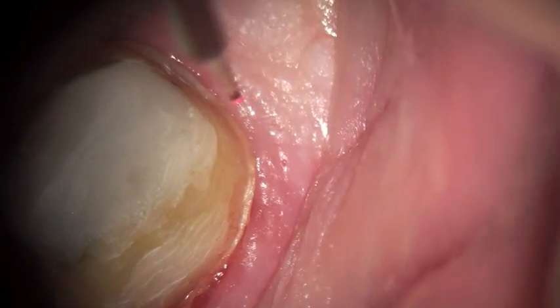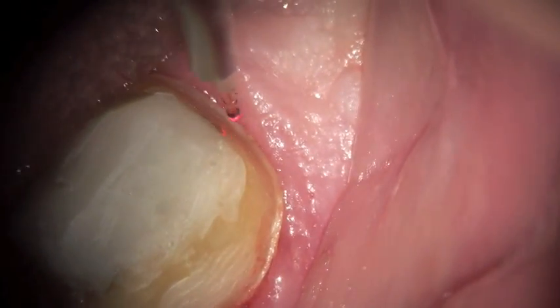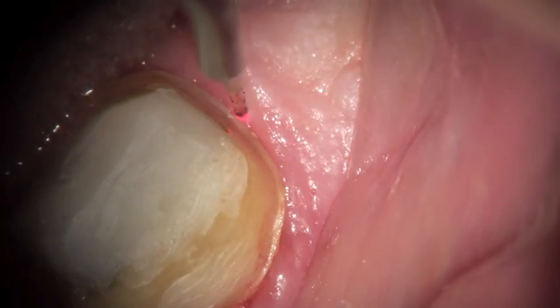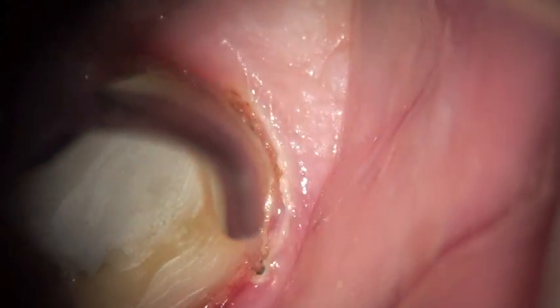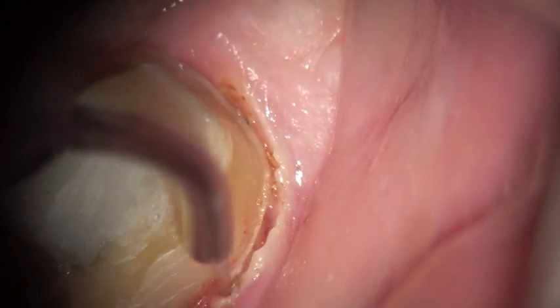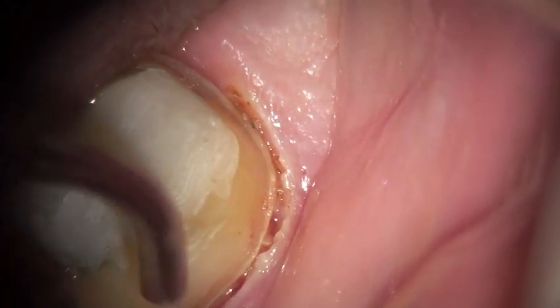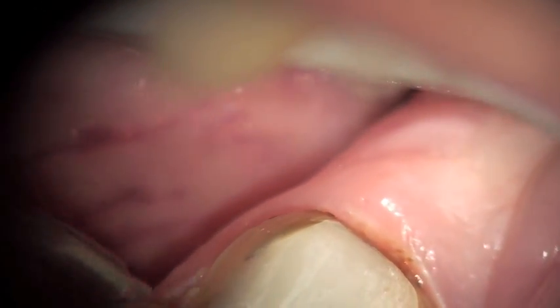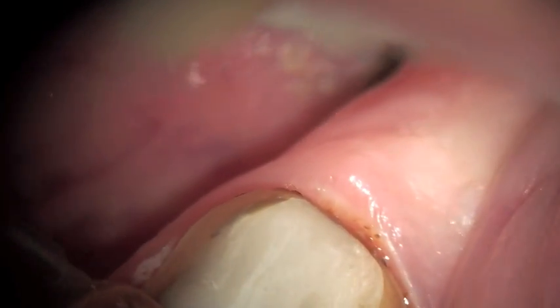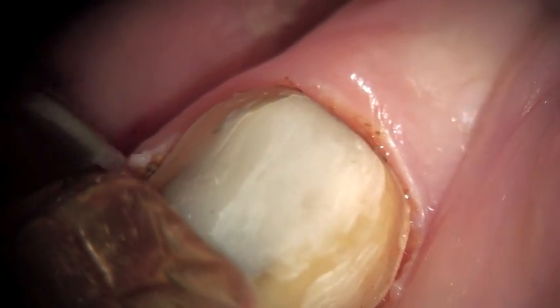You're going to see the laser tip here is initiated. You can see that the whole process took us about 71 seconds. You can see short brush-like strokes, and the intent is just to widen up the trough and not to completely go into the sulcus. On the lingual aspect, we're angling towards the tooth and creating a slight trough that is a half to one millimeter deep.